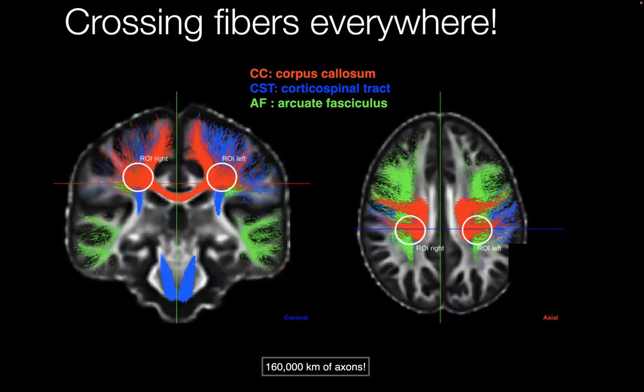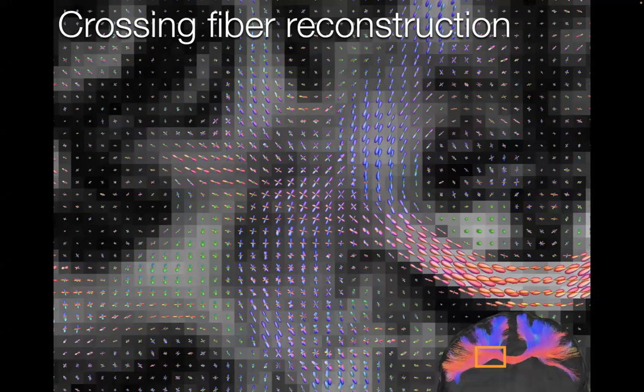So all that to say that before we started modeling tractography well, all these years that people were doing DTI tractography, to me, they just had in their hands a low order approximation of the white matter. It's not that it was wrong. It's just that they were missing a lot of connections. A lot of false negatives.